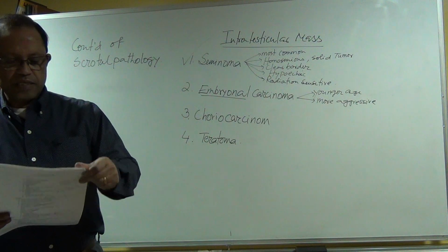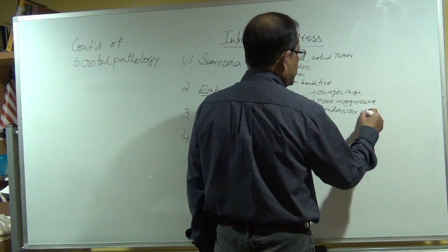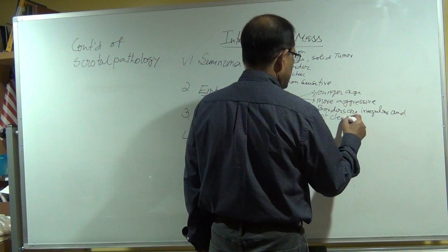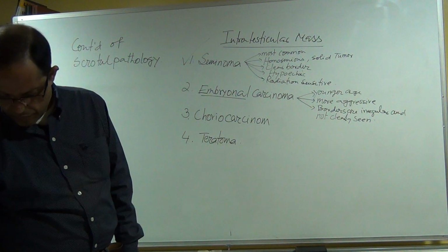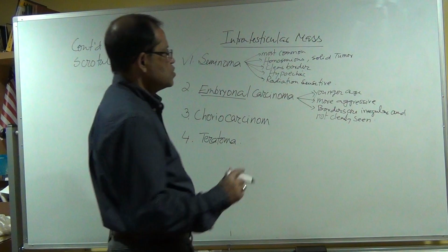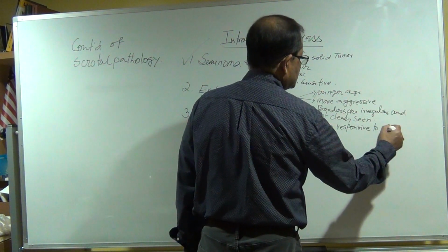Borders are irregular and not clearly seen. And it is non-responsive to radiation.